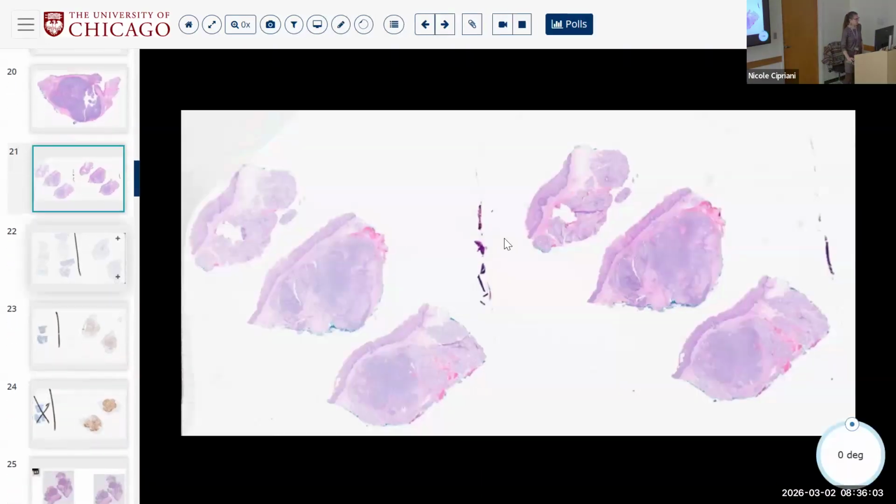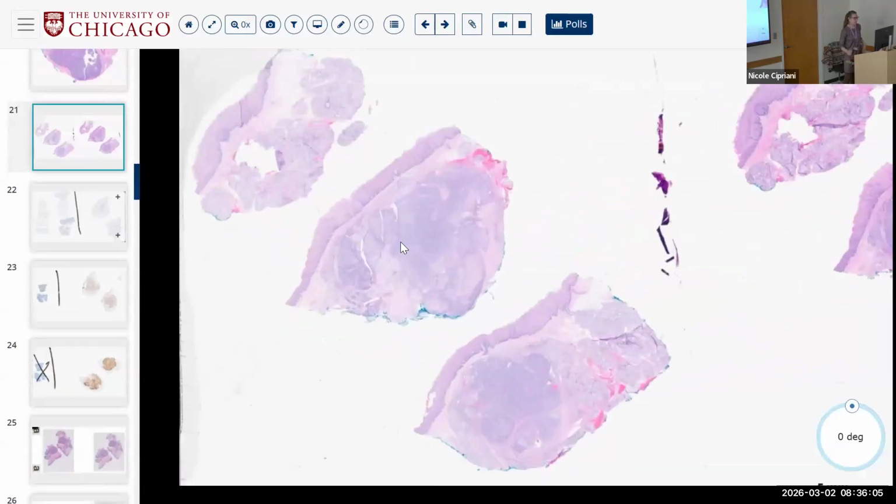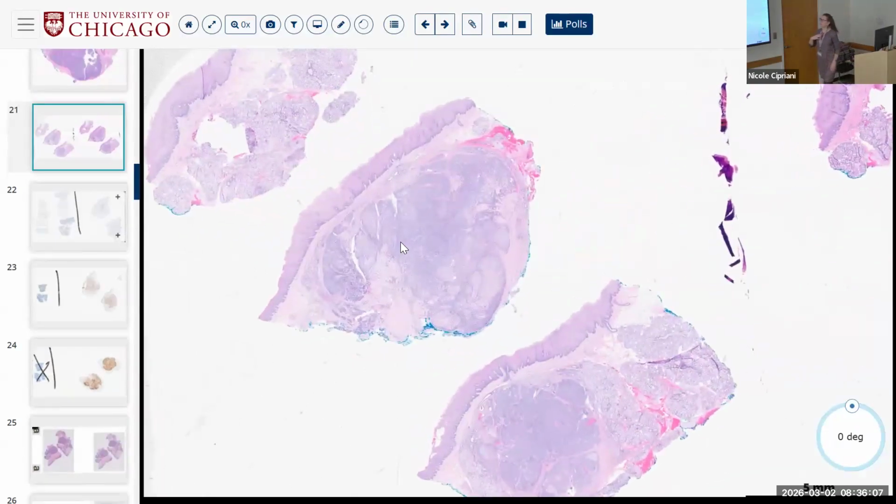Okay. All right, next case. So here we're dealing with a lot of these intraoral, palatal or minor salivary gland biopsies, because I'm not sure how often you guys see these. Sometimes they pop up on Mark Lingen's service. So I wanted to give you the opportunity to look at them.